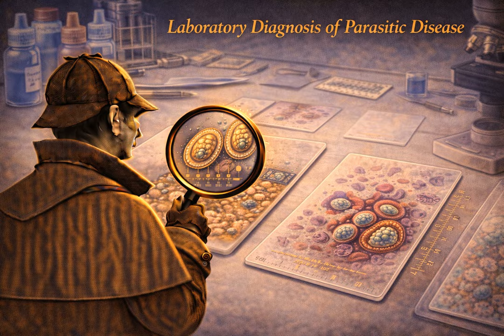They will just run the standard O&P, the report will come back negative, and you will miss a patient who is literally teeming with Cryptosporidium. That is a huge practice-changing takeaway right there. Standard O&P does not cover the entire waterfront.